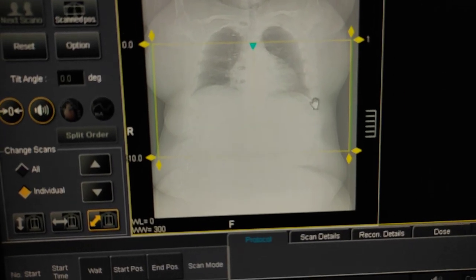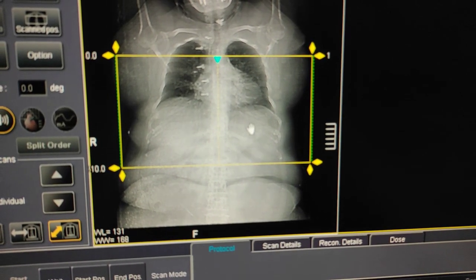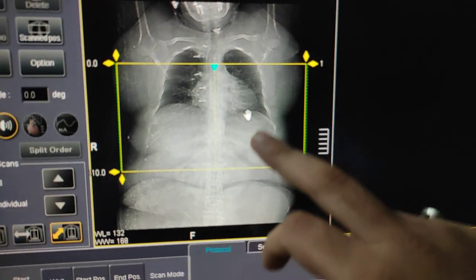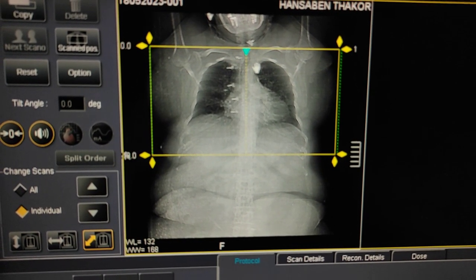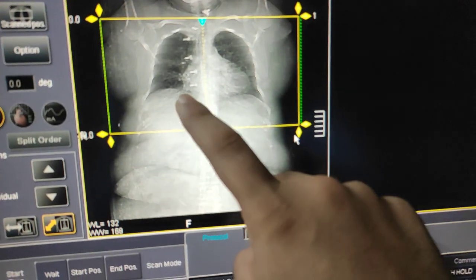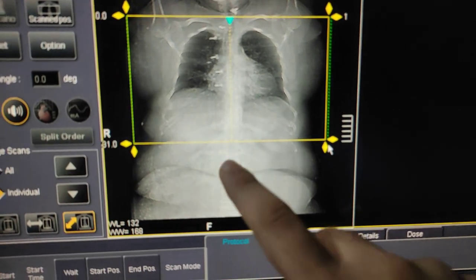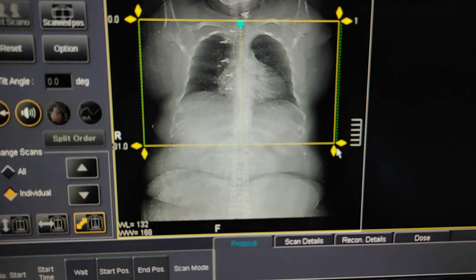Now here is the scanogram. I will show you the starting point and the ending point. Always remember you have to cover the diaphragm area — this is the apex. You can take top to bottom or bottom to top. The starting point is the apex of the chest, and you have to cover up till D12 level — this is the last rib, the D12 level.